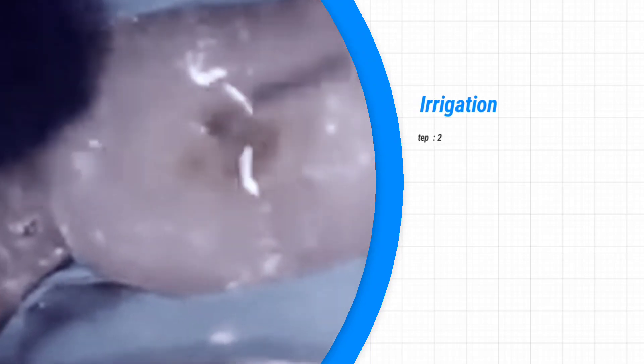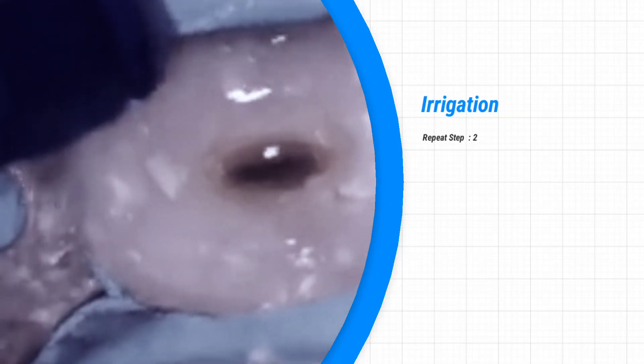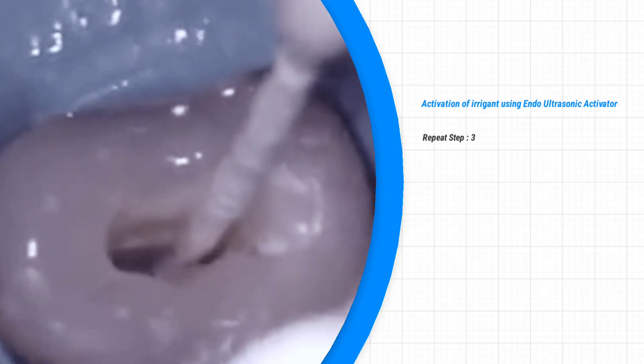Continue repeating the cycle: prepare the canal with a file, irrigate with sodium hypochloride using a side vent syringe, then agitate with the ultrasonic endo activator using short vertical strokes for around 30 seconds.